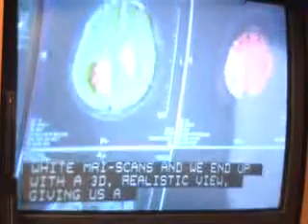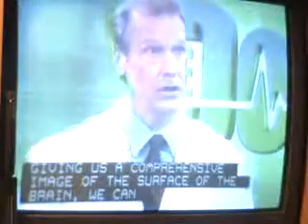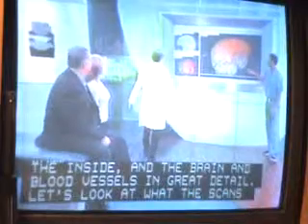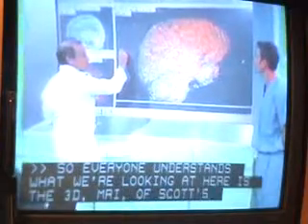whether there's atrophy of the inside components of the brain that you just demonstrated, and also the brain blood vessels in great detail. Let's take a look at what the scans show us. And so everyone understands, what we're looking at here is the 3D MRI of Scott's actual brain. Right. We see a high-resolution view of the entire surface.